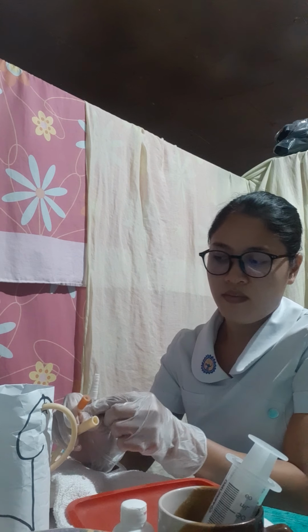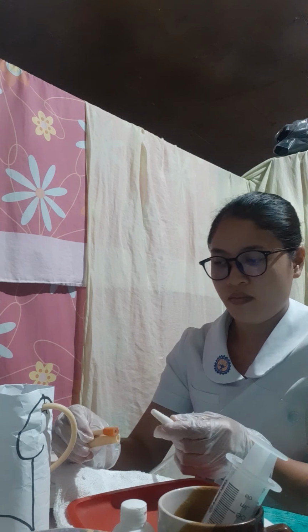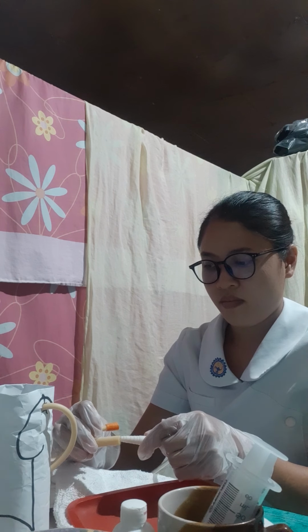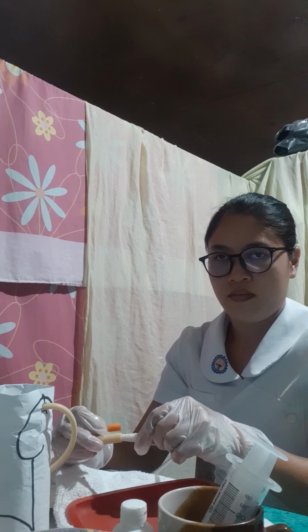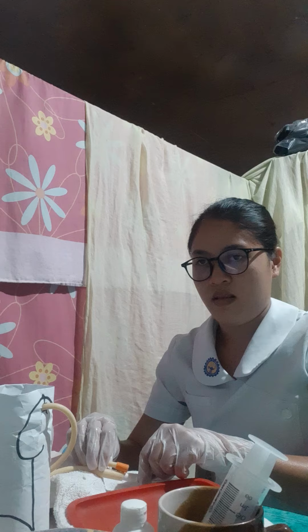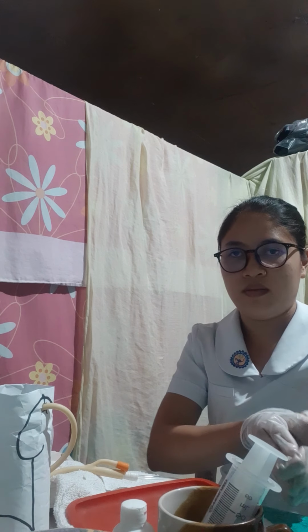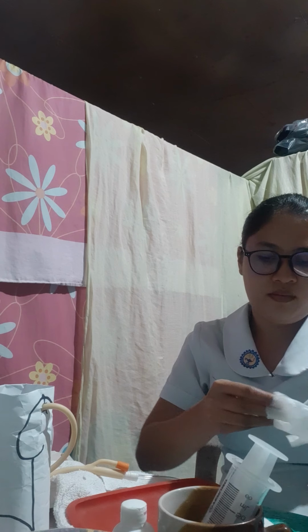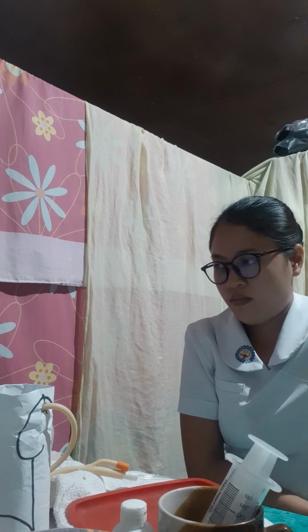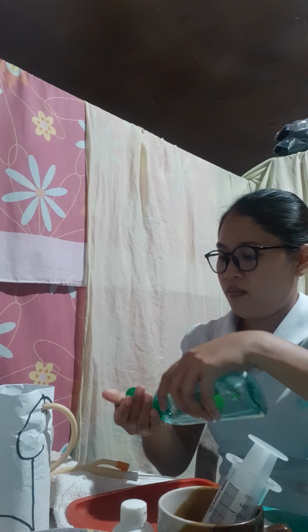And we are going to reconnect the drainage tubing. Then next, we are going to remove and discard gloves and perform hand hygiene.